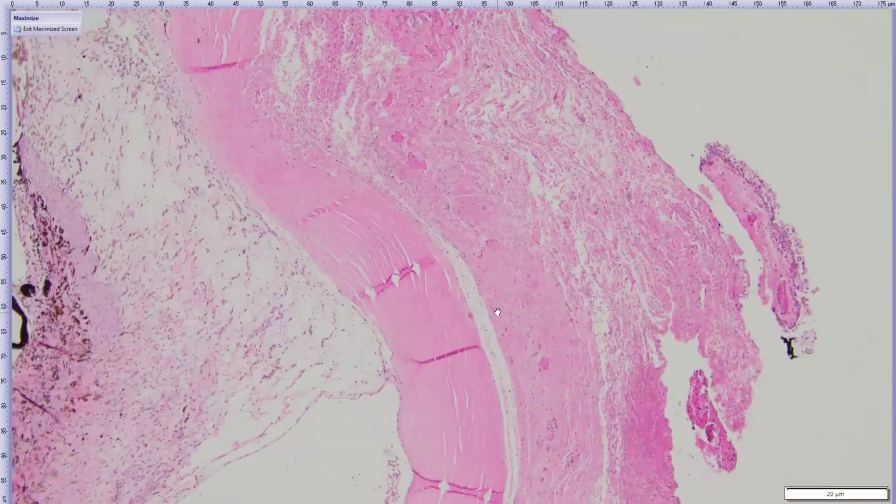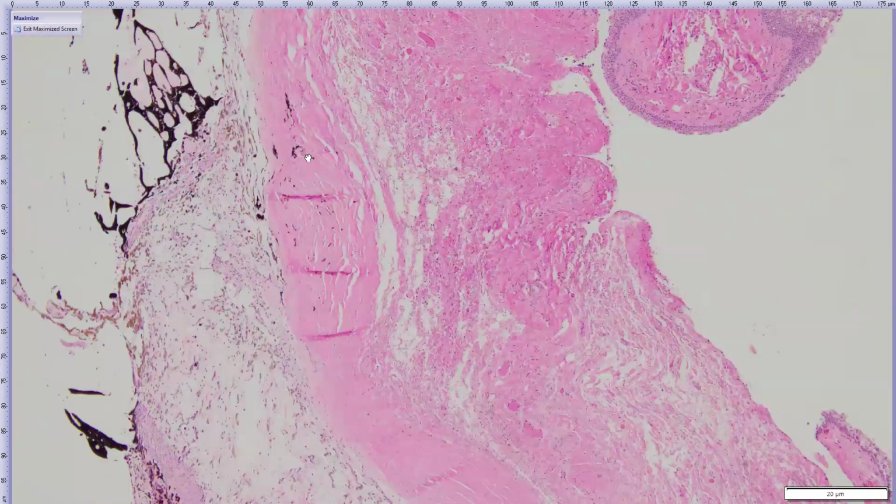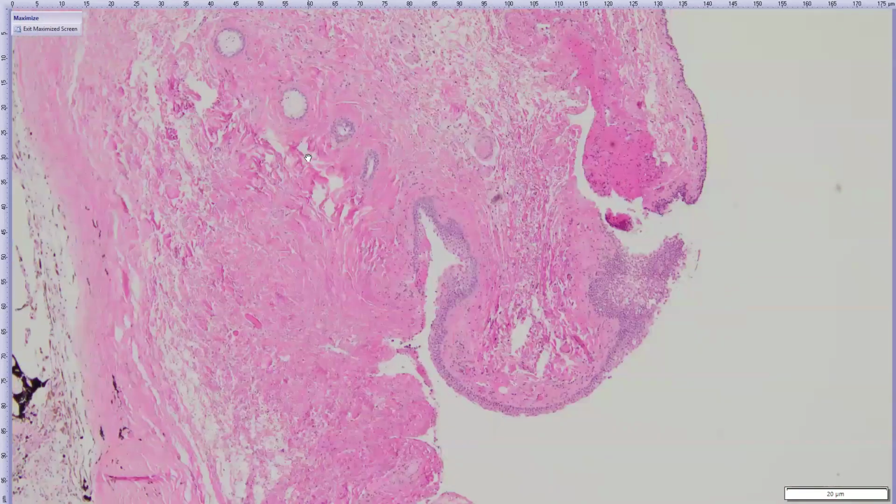As we go more axial, we lose Descemet's membrane, and instead the termination of Descemet's membrane here extends over this adhered iris tissue. So we have a little bit of iris descemetization. And as we continue to follow this corneal stroma, this is when we lose any stroma. There's this dense fibrous tissue replacing it, and then it just completely becomes the bulbar conjunctiva.